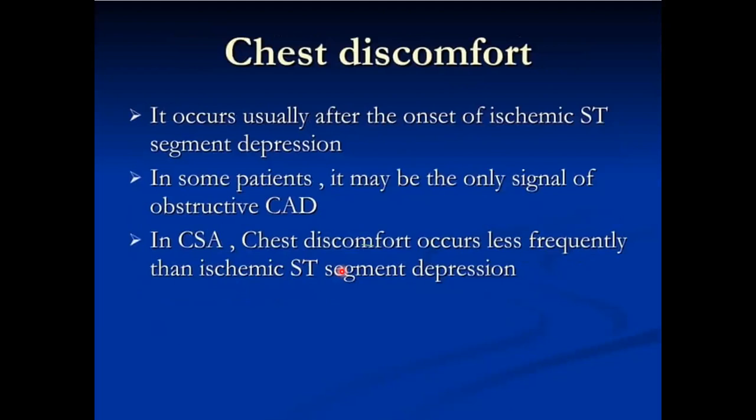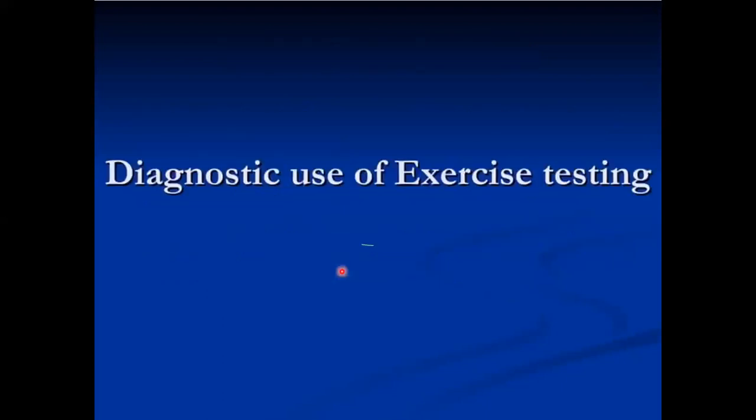Then you can assess chest discomfort also. Usually it occurs after the onset of the ischemic ST segment depression. In some patients, it might be the only signal of obstructive coronary artery disease that you get. And chest discomfort occurs less frequently than ischemic ST segment depression.